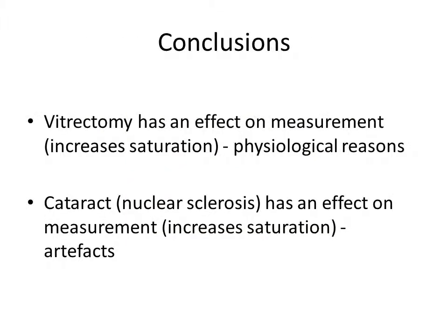So in conclusion, we can say, and this needs to be kept in mind for next research, because clinical trials are underway on many sites, that the vitrectomy eye has slightly different physiological measurements and levels of saturation.